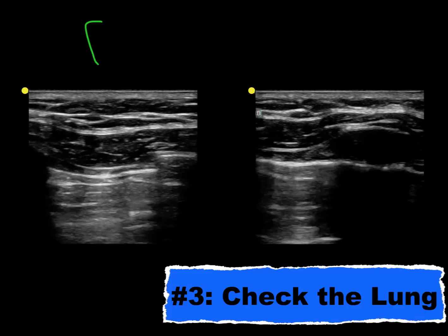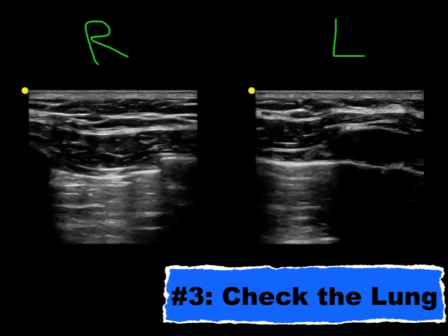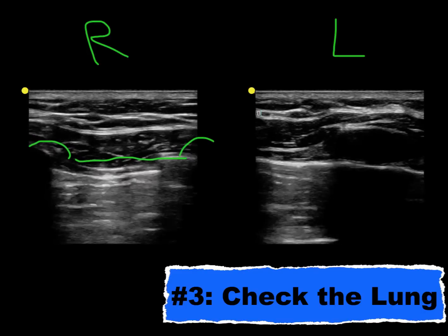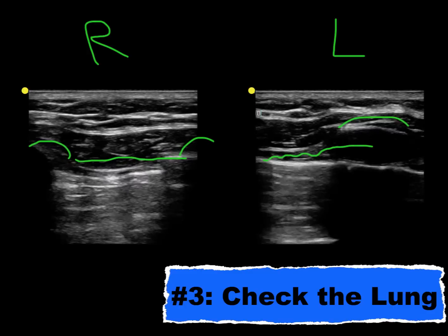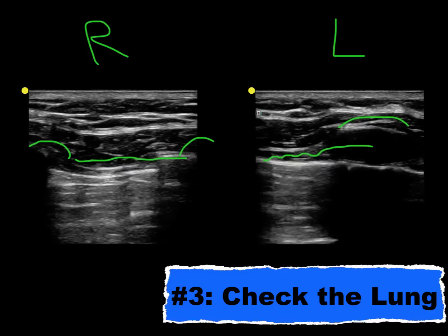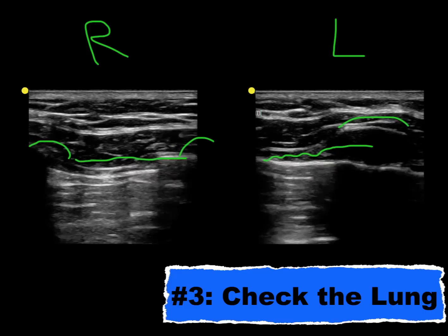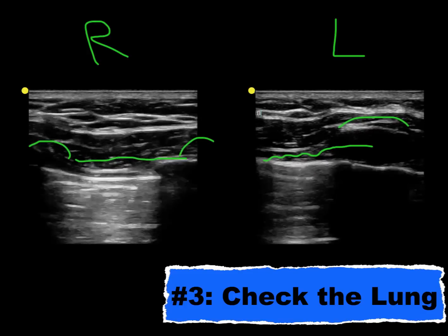What you see here on the screen is the right lung and the left lung — we see rib, rib, and pleural line, and notice that there's no sliding of the lung on the right side versus the left side, the side contralateral to where we placed the central line, where we see lots of pleural line movement. So now you know that you've caused a pneumothorax on that side. If it doesn't look significant, this is a person you might watch, put them on 100% oxygen, and of course, if it's significant, now you know they have a pneumothorax without waiting for that chest x-ray.